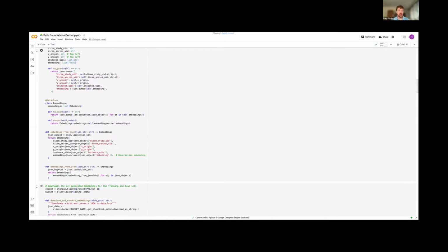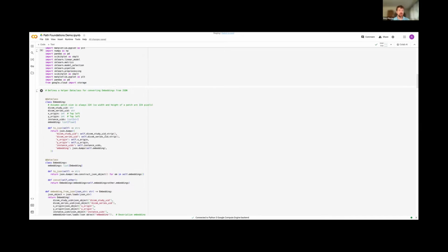We take these patches and train a very simple linear classifier. A linear classifier is kind of like a sum product. The dimensions are 384 numbers, and what we have to do is take the 384 numbers and work out what combination best represents a tumor.